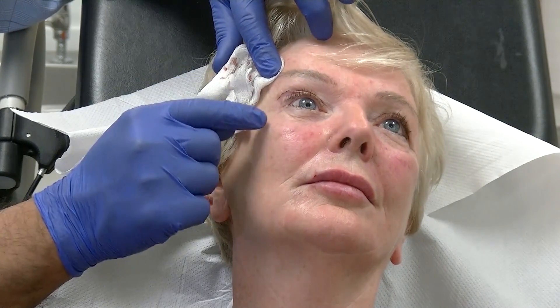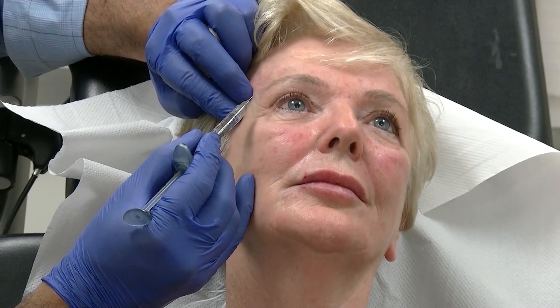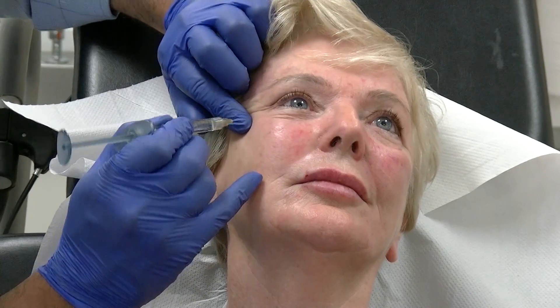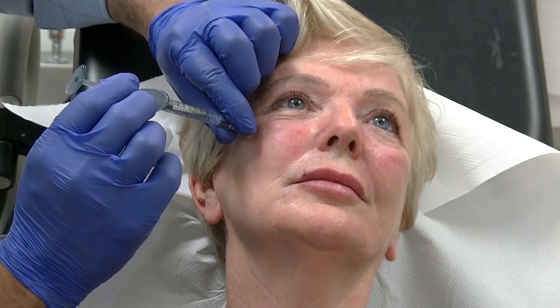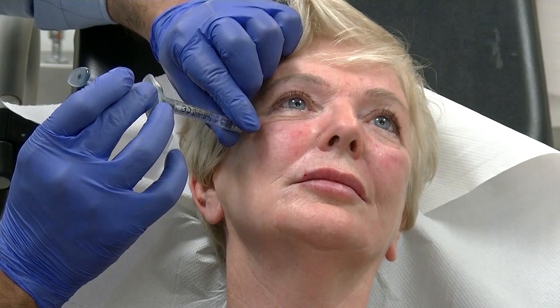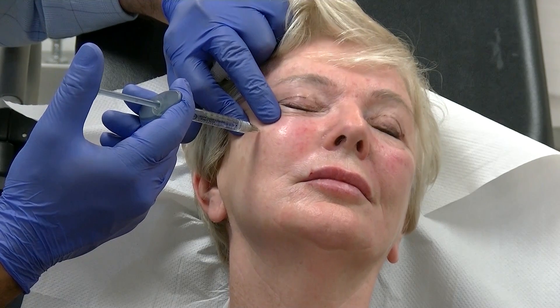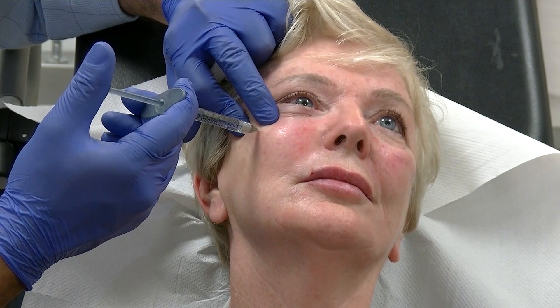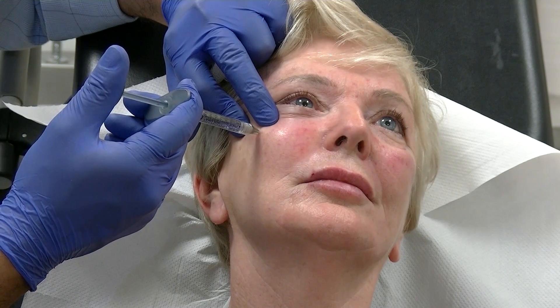Next we'll be doing three injections into the cheeks — that'll be part of the cheek video and also the 8.0 video. First injection point is the lateral brow, and we drop our line down to the point of the cheek. We elevate, sharp scratch down to the bone, aspirate and inject 0.25 ml, using our middle finger to protect the orbital rim so that the product doesn't go into the eyelid — stays in the cheek.